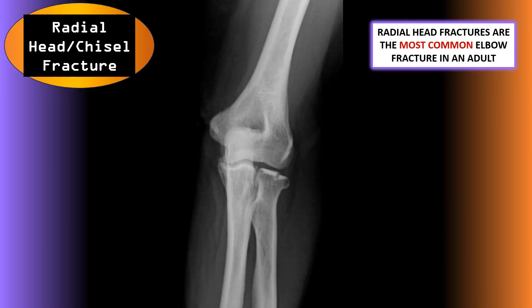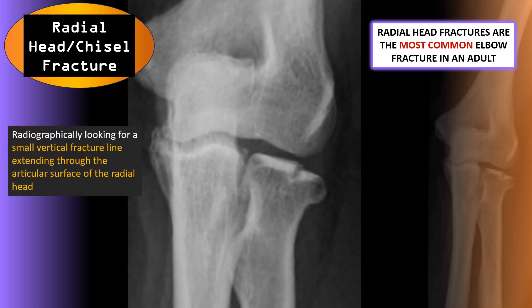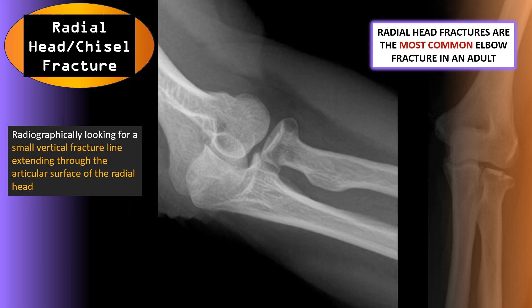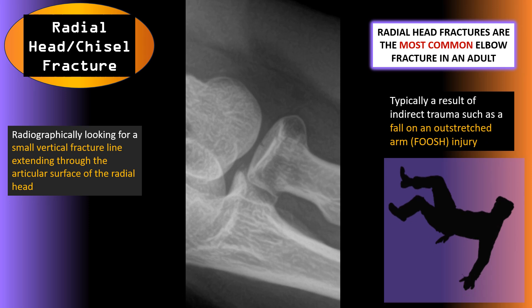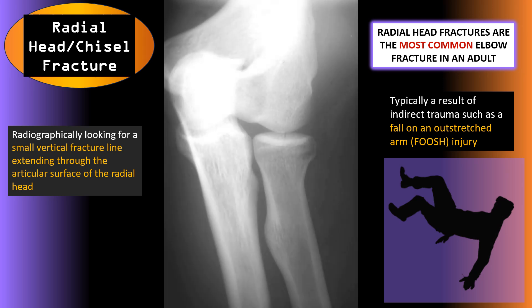Radial head fractures are the most common elbow fracture in an adult. Radiographically, we're looking for a small vertical fracture line extending through the articular surface of the radial head. These are usually a result of indirect trauma such as a fall on an outstretched arm — a FOOSH injury. These fractures are really subtle and very difficult to see; here we can just notice a small radial lucency, and that is the fracture. Sometimes these fractures are only visible on one projection, so make sure you're looking at frontal, lateral, and oblique projections.